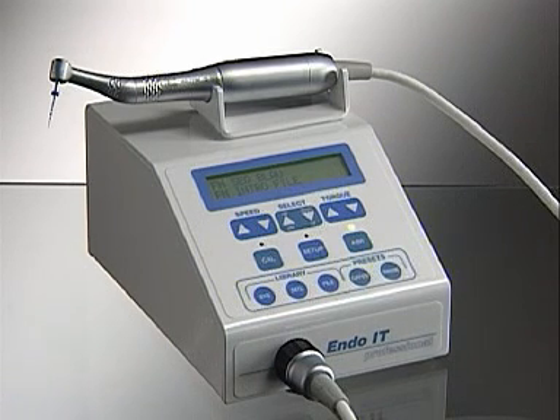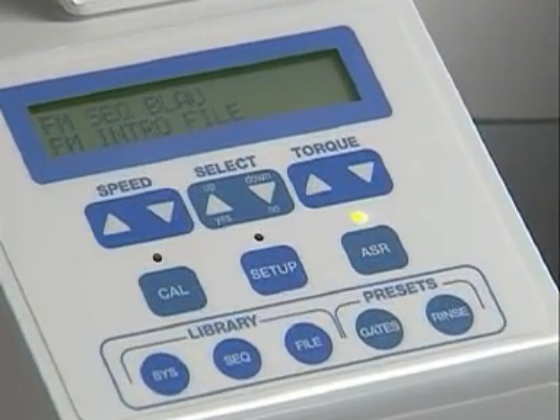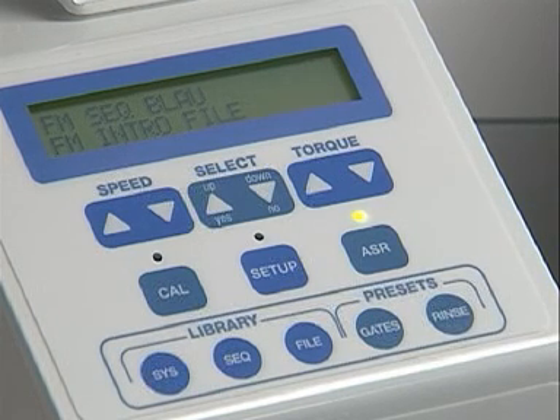An intelligently programmed motor with torque and speed control allows you to work with optimal efficiency. Such a motor monitors the speed and torque specific to each instrument precisely and safely.